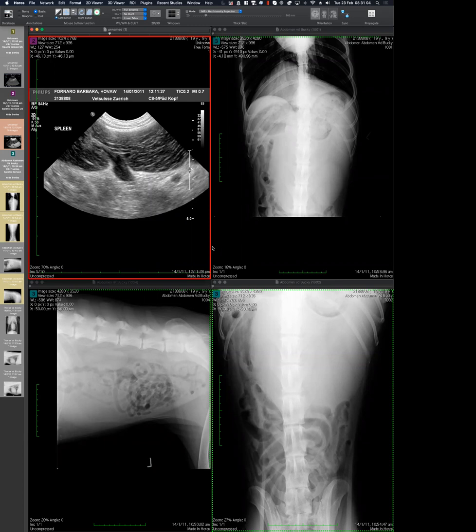I totally agree. Coming from an emergency perspective, if you put the ultrasound on and it looks like a hemangiosarcoma, you're going to have a very different conversation with an owner going into surgery compared to something that is potentially fixable, even if you don't find mets. Obviously, not everyone's got an ultrasound, but if you've got it available, you should be getting as much information as you can before going to surgery.